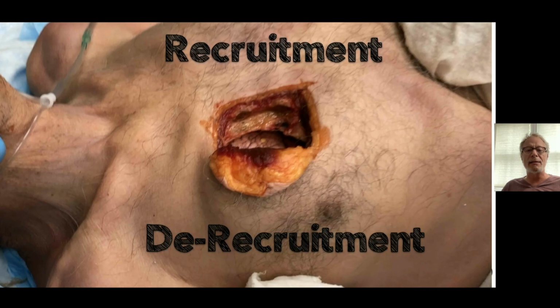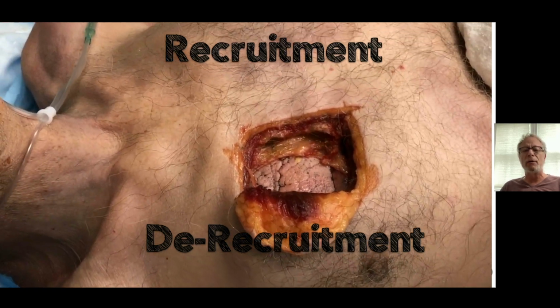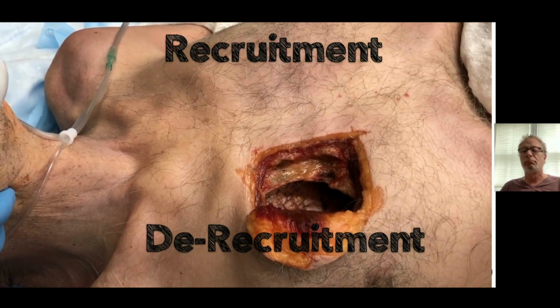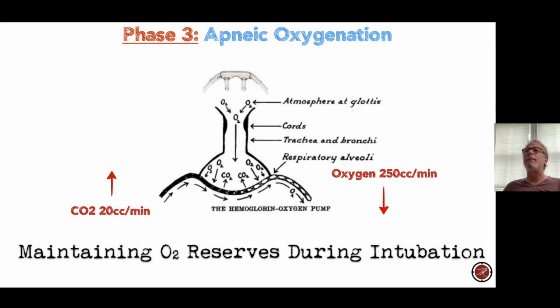This is what I mean by de-recruitment. So what you'll see: recruited, remove mask, boom. That happens immediately. So what we want to do is continue applying oxygen.